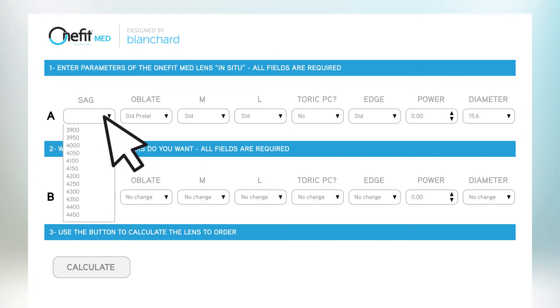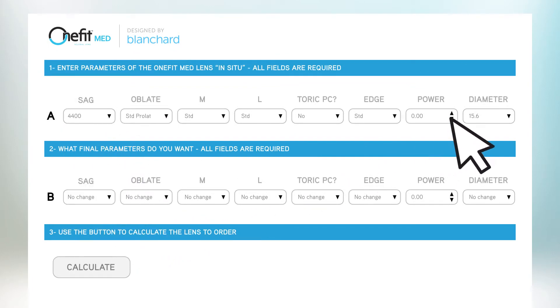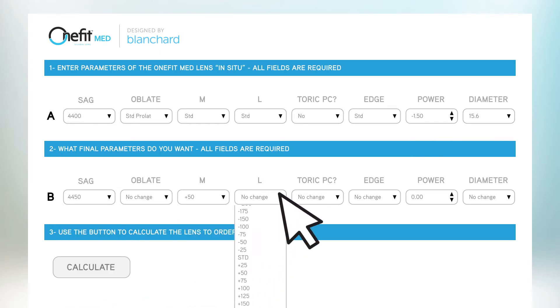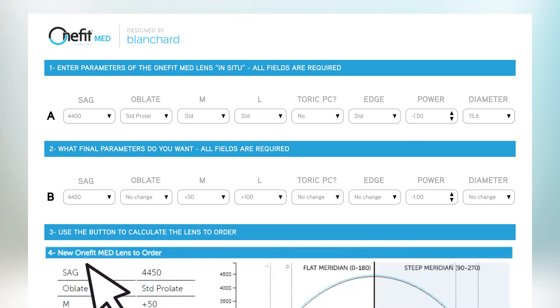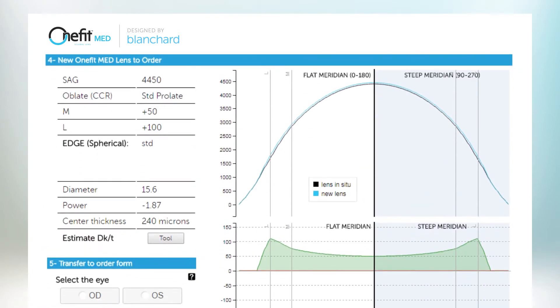The easy-to-use online fitting tools help you calculate the final lens parameters and give you a graphical representation of the new lens you designed.